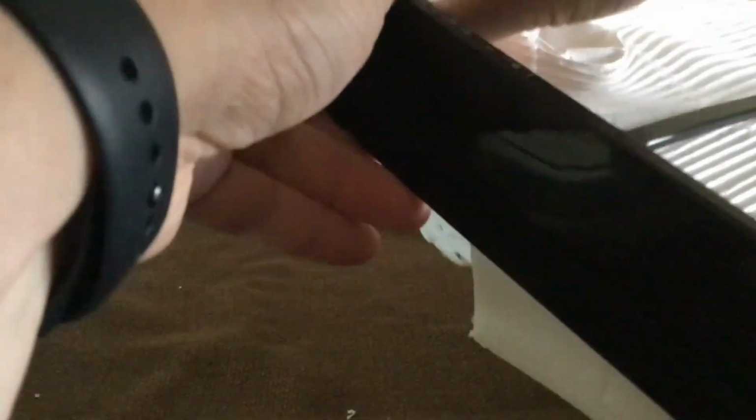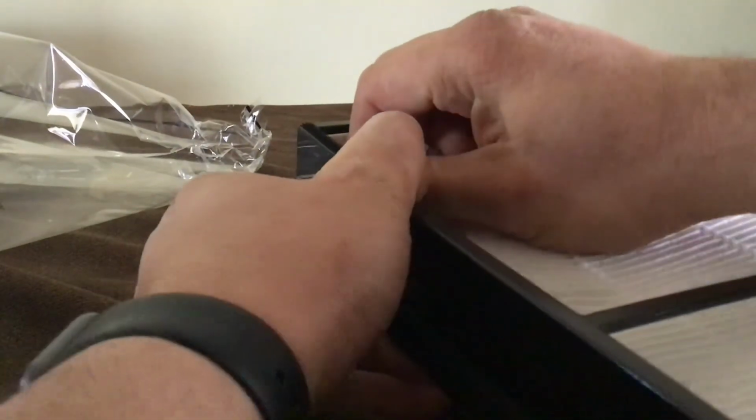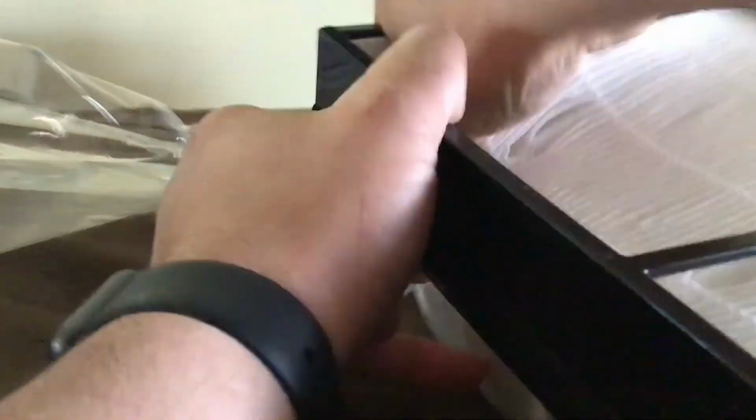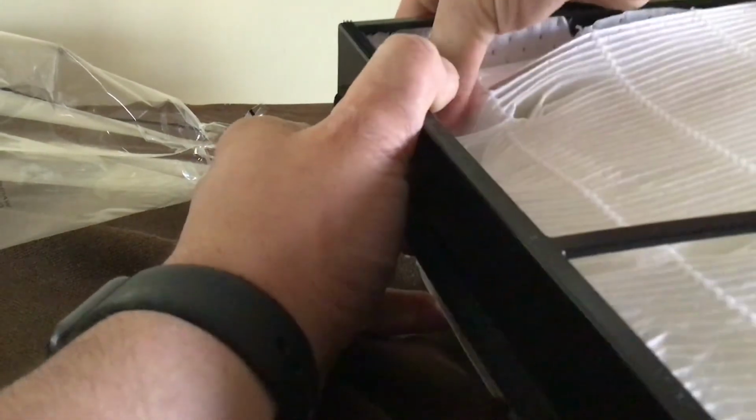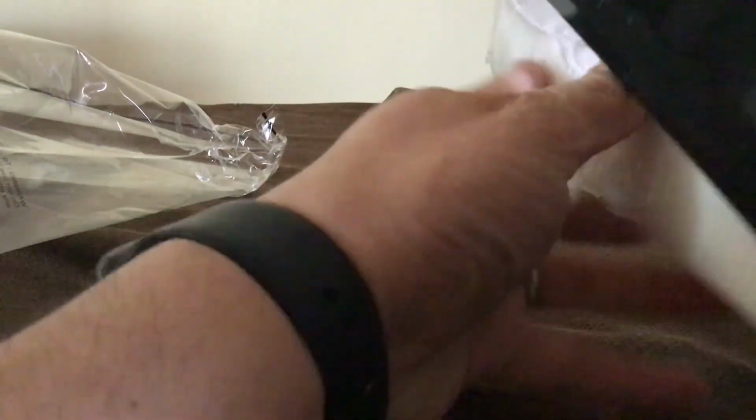You're going to want to continue going along the edge so that you don't accidentally tear the filter too much like I just did there. Just freeing it from the frame like so. If you have a heat gun, that will also help by melting the adhesive. So now we have one side fully freed on here.